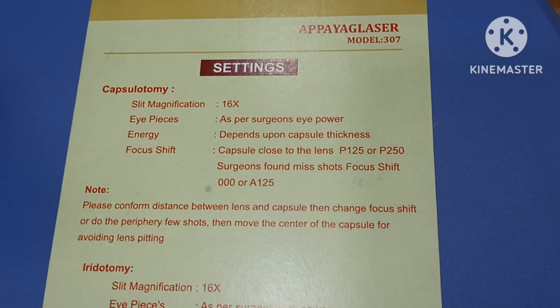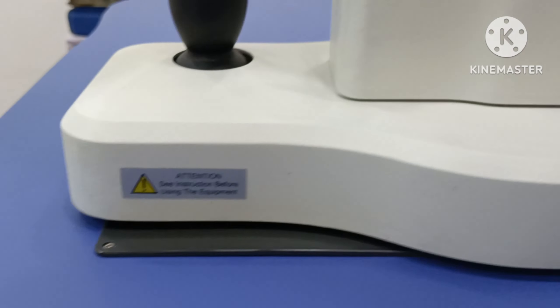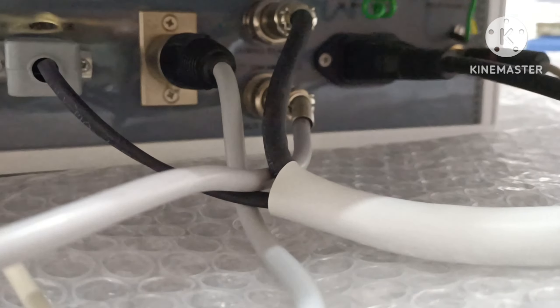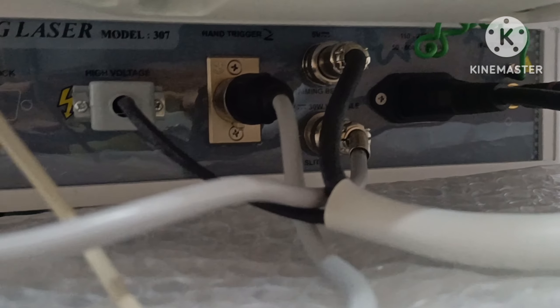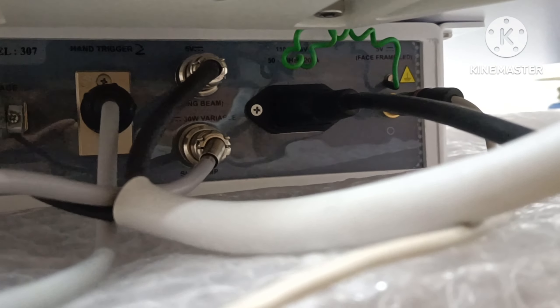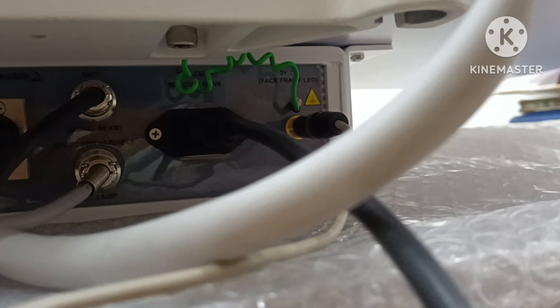Settings. Here is wire available, and trigger, high voltage, aiming beam connector, power cord.